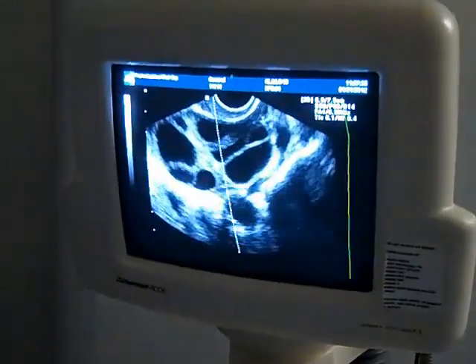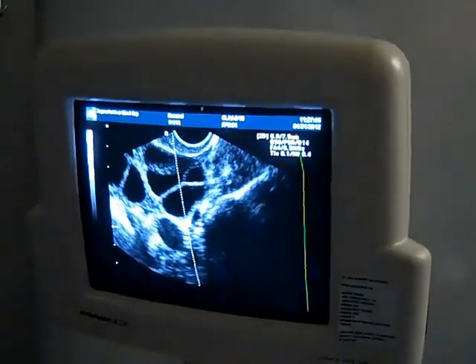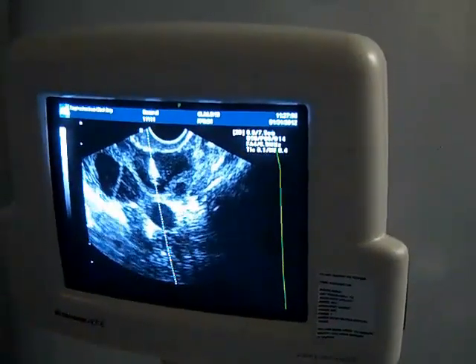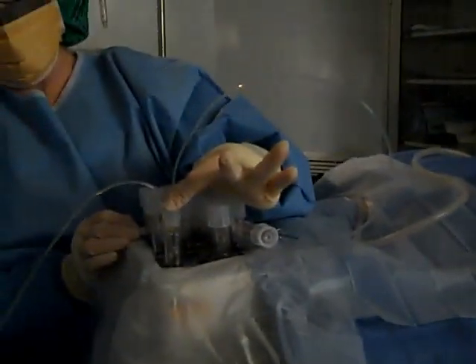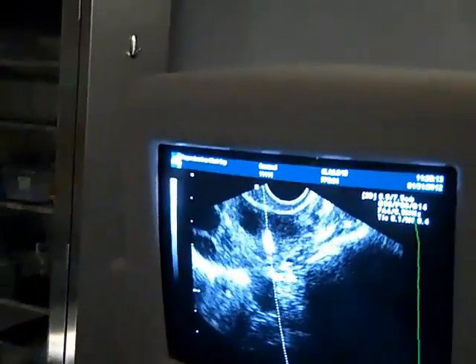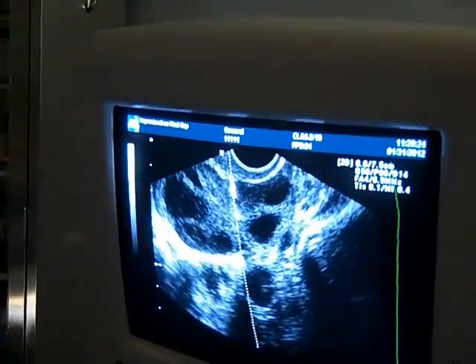So this is the ultrasound machine. Dr. Tarantino is doing Liz's aspiration today. This is the ultrasound view of what the ovaries appear to be after they've been stimulated with the fertility medications that Liz has been using. We can watch and observe the needle passing into the follicle and collecting the fluid. The needle is inserted in a very gentle manner and is not removed completely, but goes from one follicle to the next.